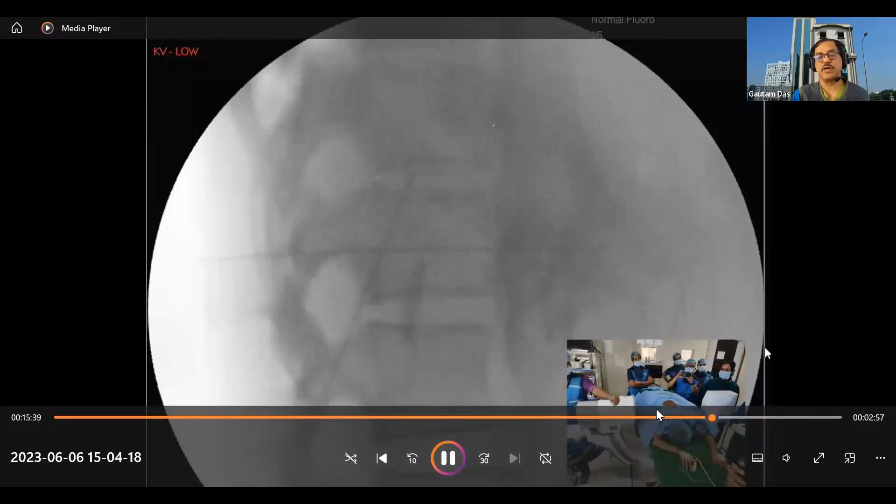This is the modified technique where we go through and through the aorta, positioning the needle in front of the aorta. This approach has a better success rate.